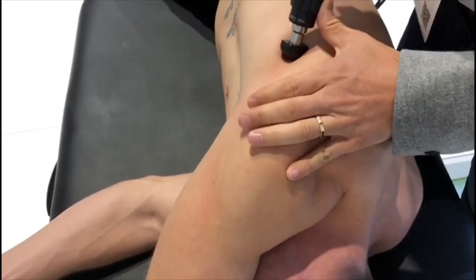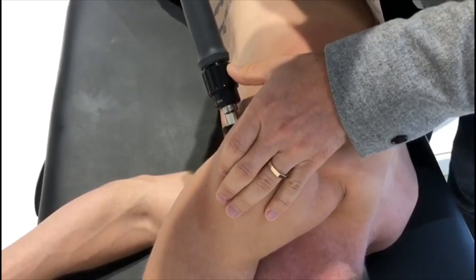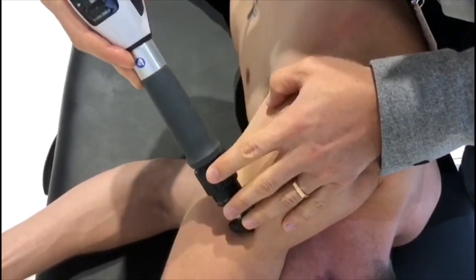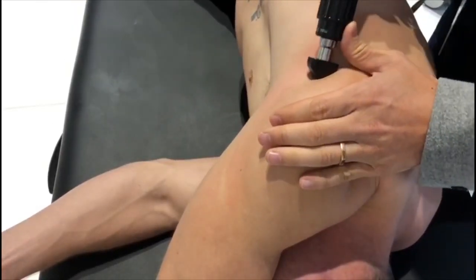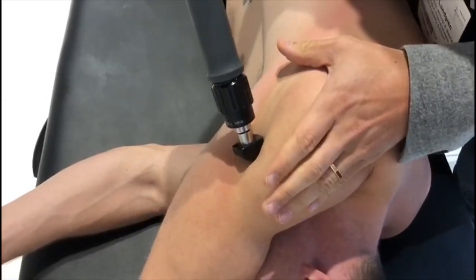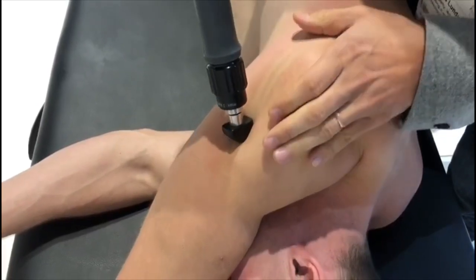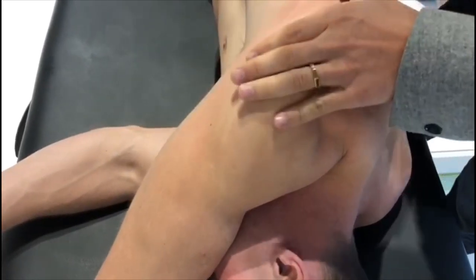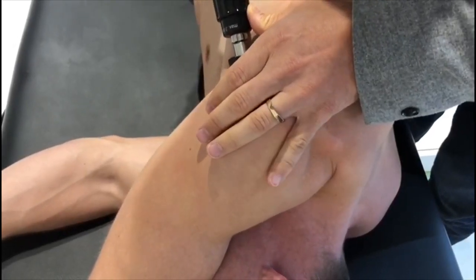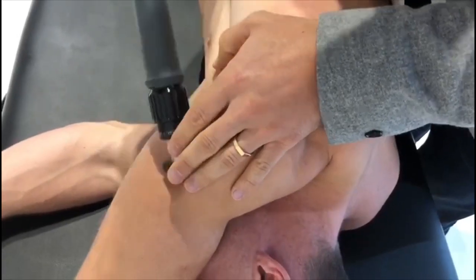You will probably have some nice color on your skin afterwards. So it's working. So this region here slides a lot easier. I don't know if you can feel it, but there's less friction right here. While if you compare to this region here, there's a lot more friction. And this is one of the reasons for the tightness, I think.